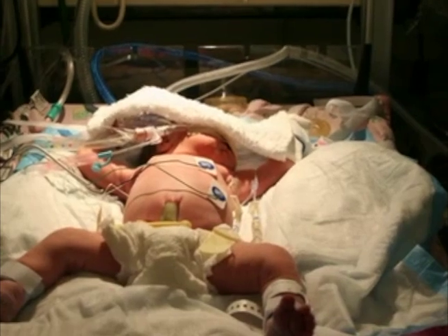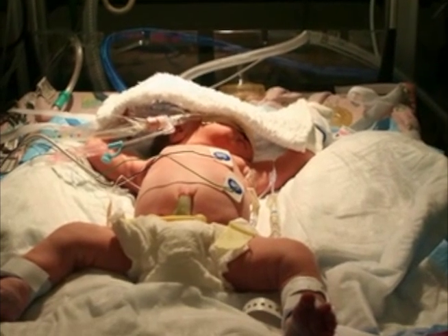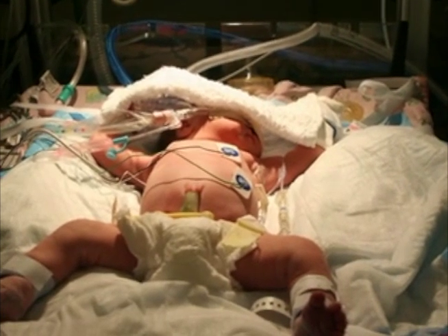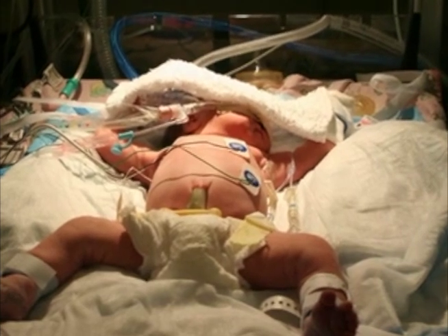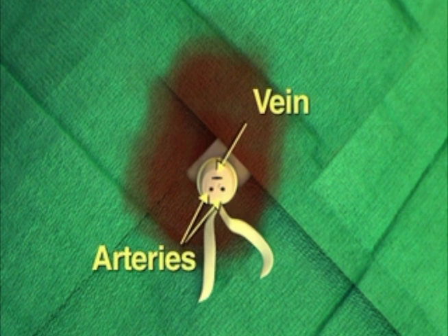After the procedure has been explained and consent obtained from the parent or parents, review the records and examine the patient to confirm that there are no contraindications to catheterization. In your examination, concentrate on the anatomic landmarks. You must then decide how deeply to place each line.